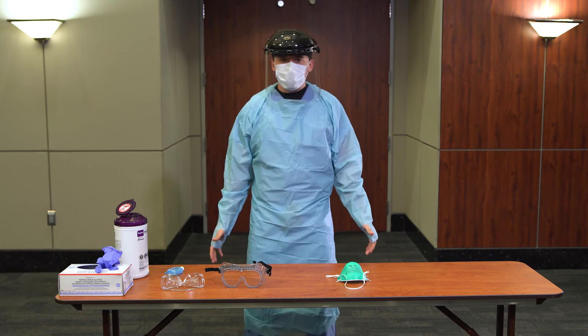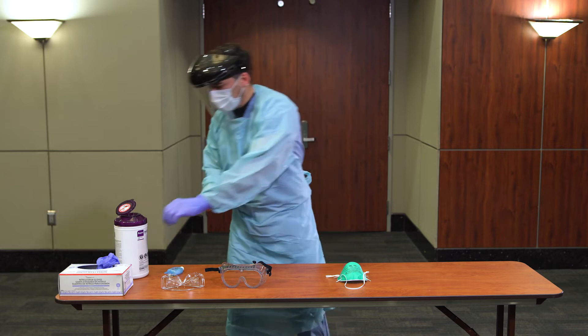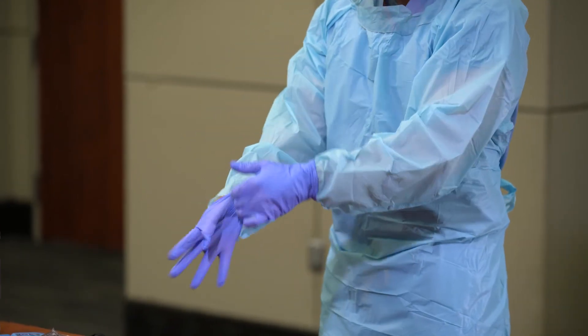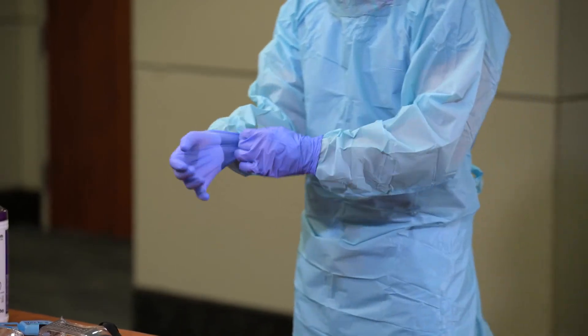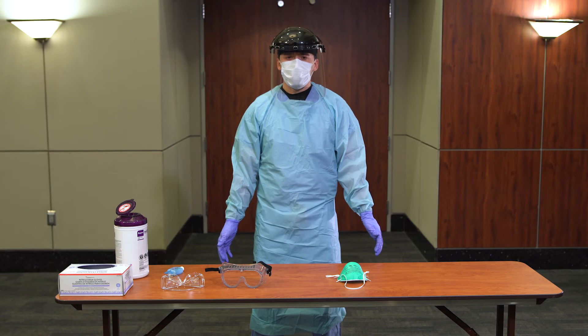Don gloves. Gloves should not be too tight or too loose. Tight gloves could potentially tear, and loose gloves will hinder your ability to perform certain patient care tasks and may come loose. You may now enter the patient's room or care area.